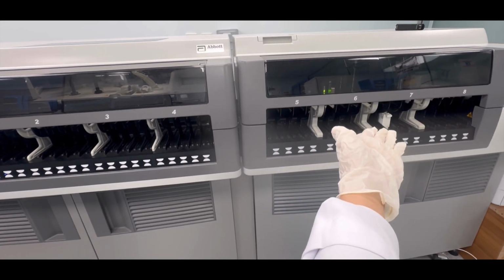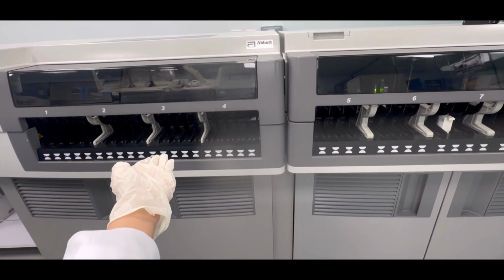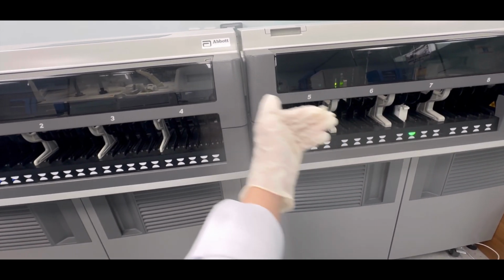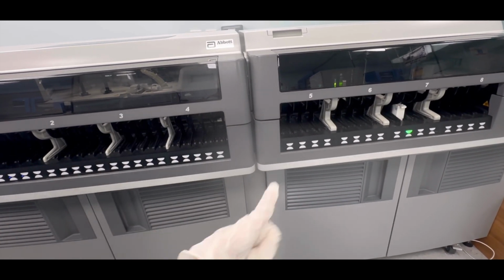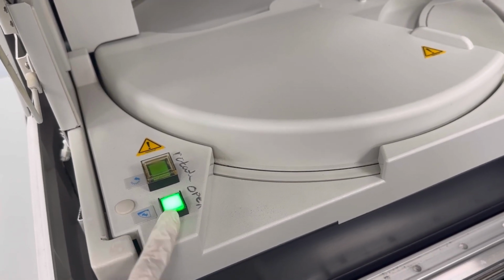So guys, as you can see, this is the Architect machine. This is fully automated. This is the hormone side and this is the biochemistry side. This whole thing includes the biochemistry side and the hormone side, so both make up the whole Architect machine, and it is fully automated.